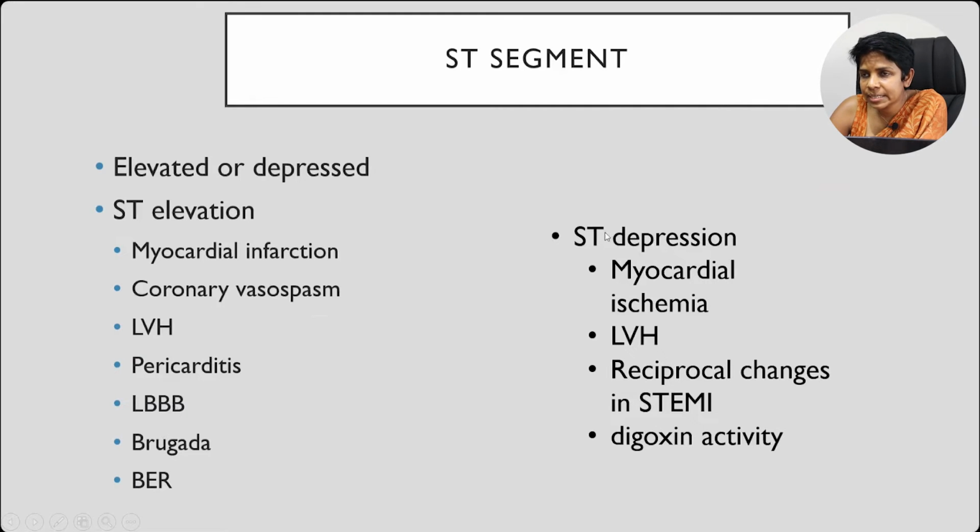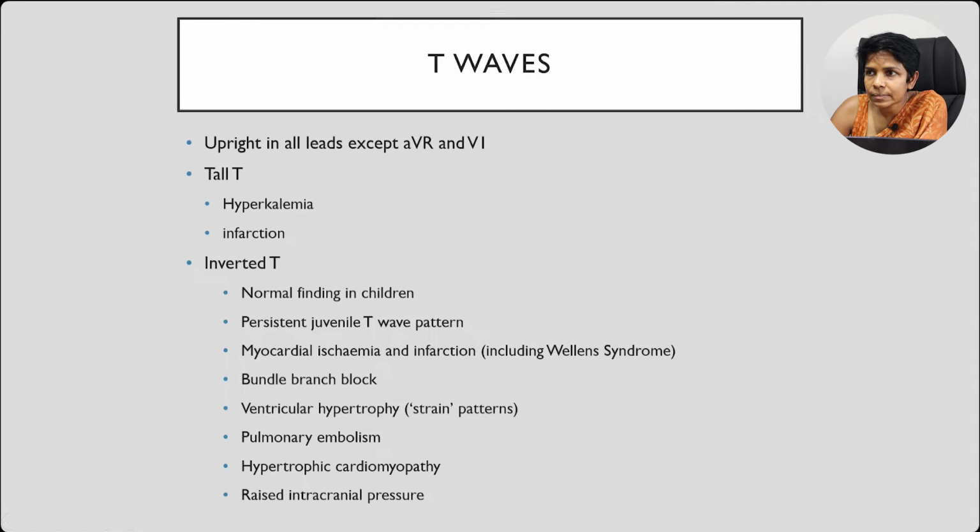In the same way, ST depression usually indicates myocardial ischemia or infarcts, but there are certain other conditions that can give rise to ST depressions in ECG. I will quickly go through this one also.